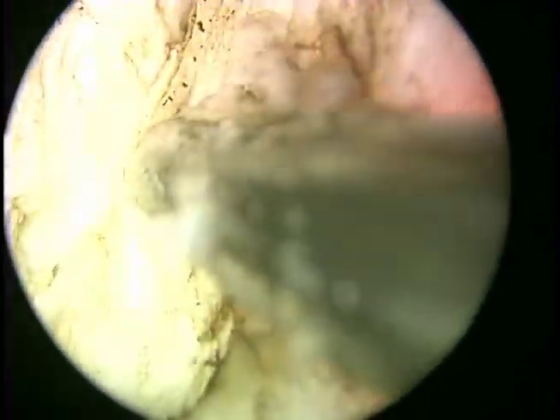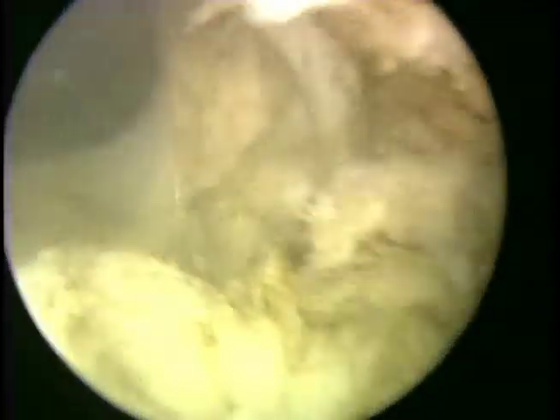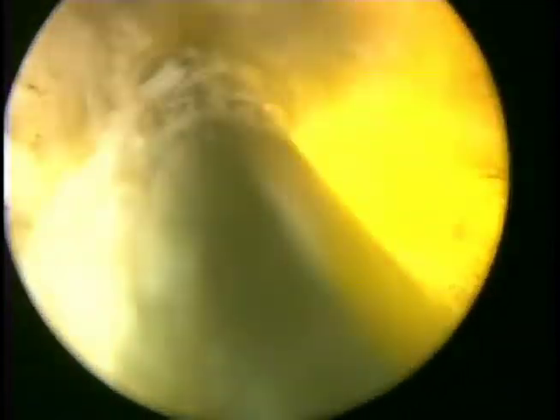As expected, when we do get to the surgical capsule, there are often small perforating vessels that we may encounter, and simply taking the time to compress, identify the exact location, and then use the coagulation setting pedal to achieve good hemostasis. This is part of one's learning curve, and once treated, we can return to regular tissue removal with vaporization, as we can see here.